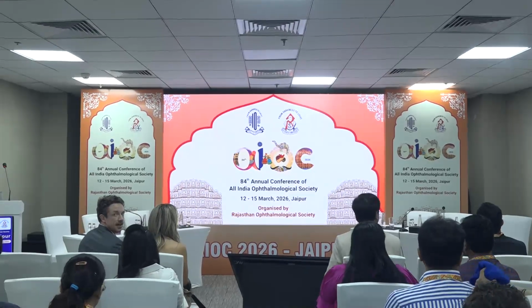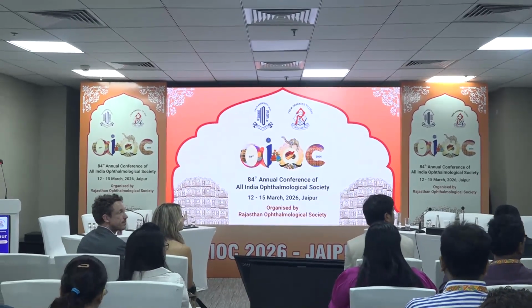So wonderful coverage of patients with vitrectomized eyes. I just saw that you pointed out that intracameral xylocaine or whatever is used might percolate through the loose zonules in such cases, through the degenerated zonules, right? Because the silicone oil has a degenerative effect on the zonules. My question was, many of these vitrectomized patients are high myopes. They must have had an RD, and an RD surgery must be done. Now, in such cases with the thinner sclera and the globe filling the entire orbit, do you recommend a peribulbar, or would you continue with what you just said?